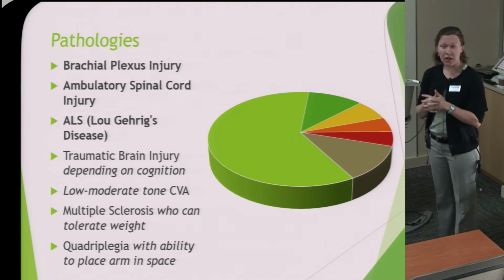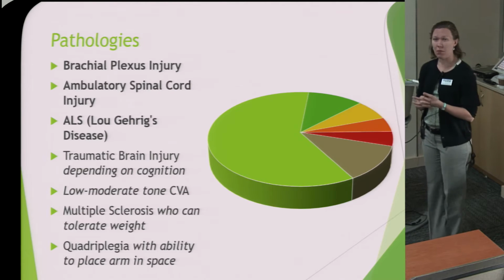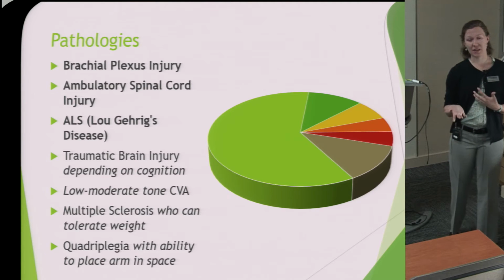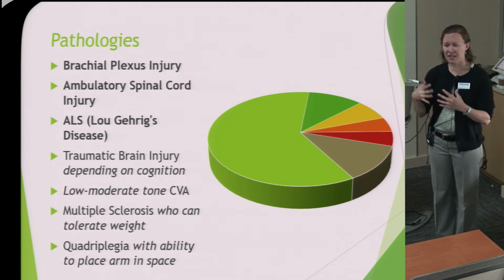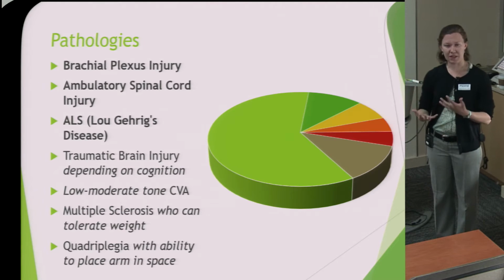They still do well. They just may not get as much as we would really like to see them do. Multiple sclerosis patients who can tolerate weight, and patients with quadriplegia who have the ability to place their arm in space. That sounds a little counterintuitive, but really what we're talking about there is, does the patient have the ability to mobilize their shoulder in order to make this functional?